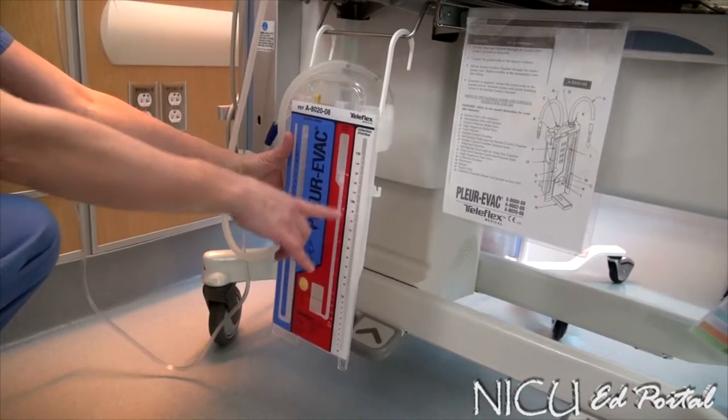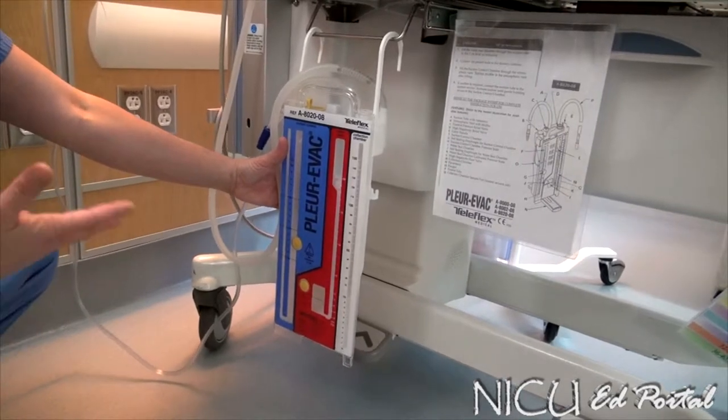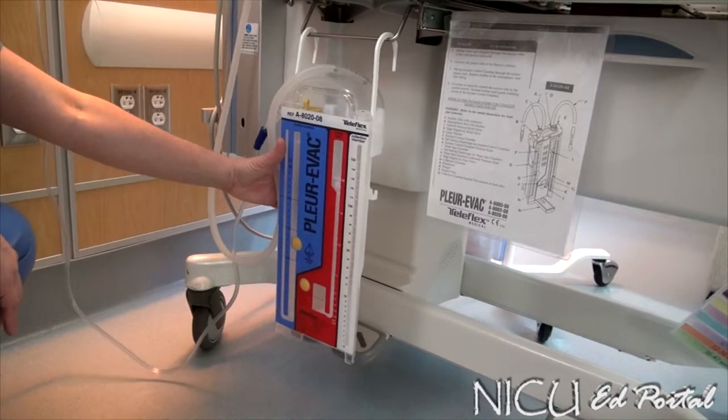The collection chamber is your last chamber, and this is where you would have fluid drainage. You need to make sure that you're keeping track of the amount and the color. In our unit, we don't see a lot of drainage unless you're dealing with a baby with a chylothorax or sometimes our post-op. But you need to be familiar with what that chamber is.